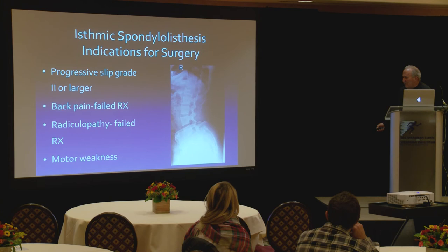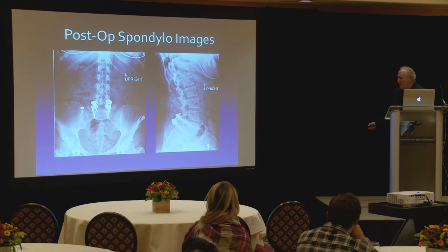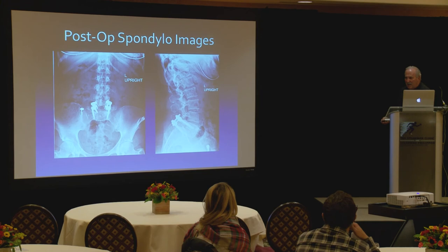And again, you can reduce them somewhat, but the key is not to pull them back too far, because the L5 root, which comes out right here, when you pull them back, the further you pull them back, the more you stretch the root. And when I was training years and years ago when dinosaurs walked the earth, I've seen a couple of L5 nerves that didn't respond well to the stretch. So I never reduce them more than a half a grade to a grade in general.